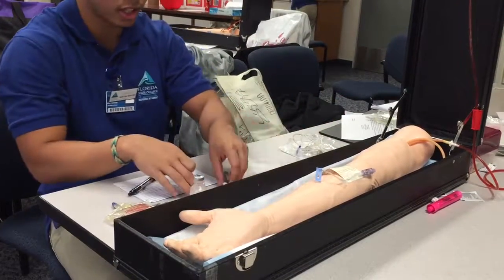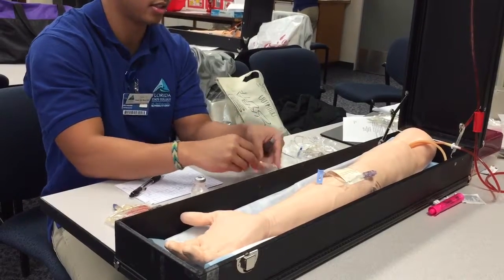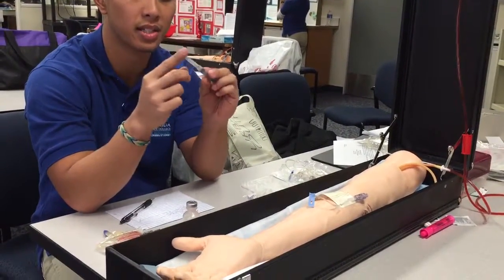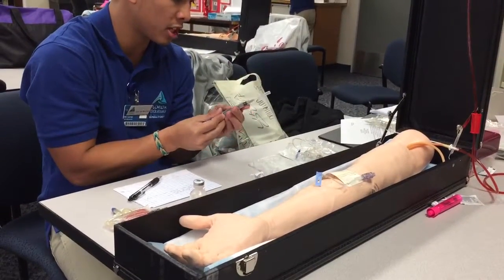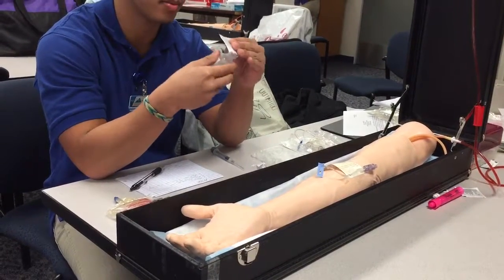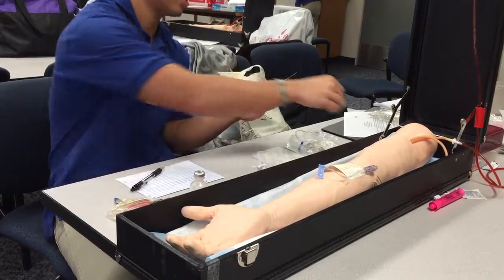For this purpose, we already have this hooked up, which we don't have a cover for, but if we did, it would still be sterile. So this is still sterile because it has a cap, and this is also a sterile syringe. I'm going to pull half a milliliter of air up. I'm going to take my alcohol pad and cleanse the top of the vial, just to make sure it's clean. Dispose of that. I'm going to take this off.